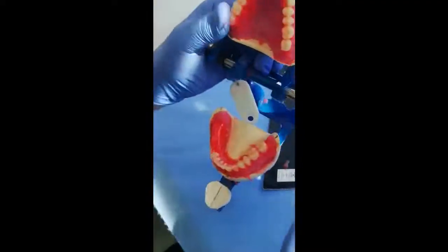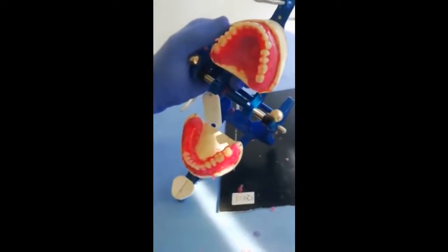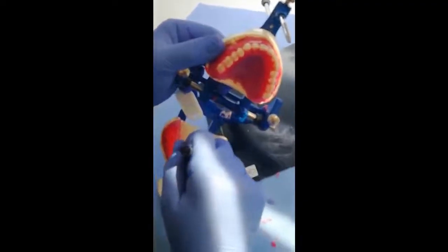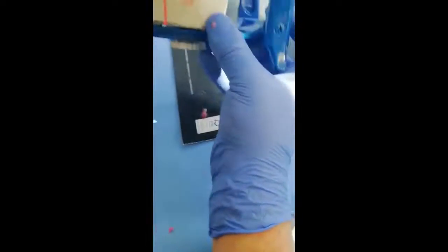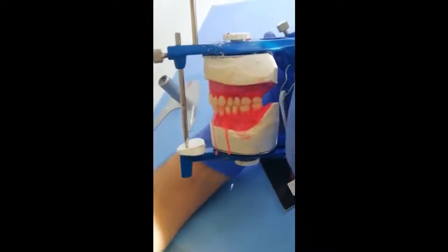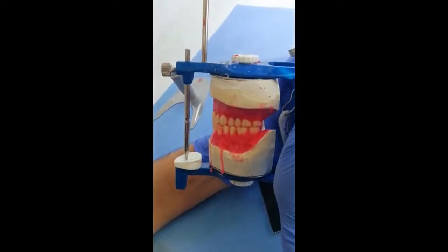Now we fix the teeth from inside, and you can see that the central fossa of the mandibular posterior teeth coincides with the crest of the ridge. Okay, now we close the teeth. Now we can observe, as I mentioned, the protrusive movement. If we put the teeth in edge-to-edge contact, we have balancing multiple points.